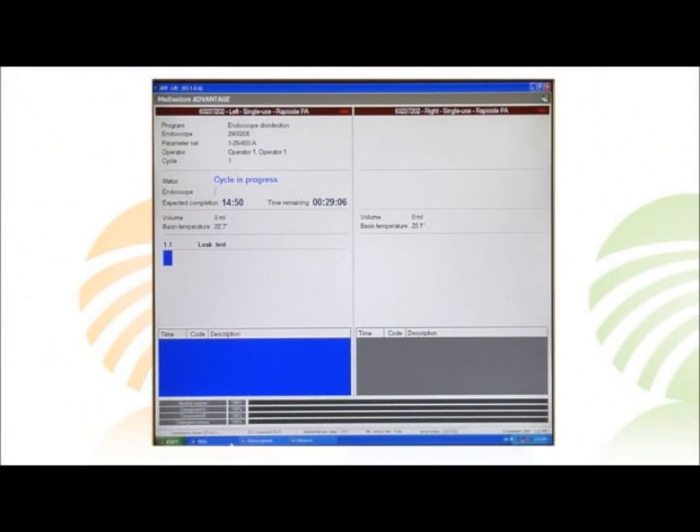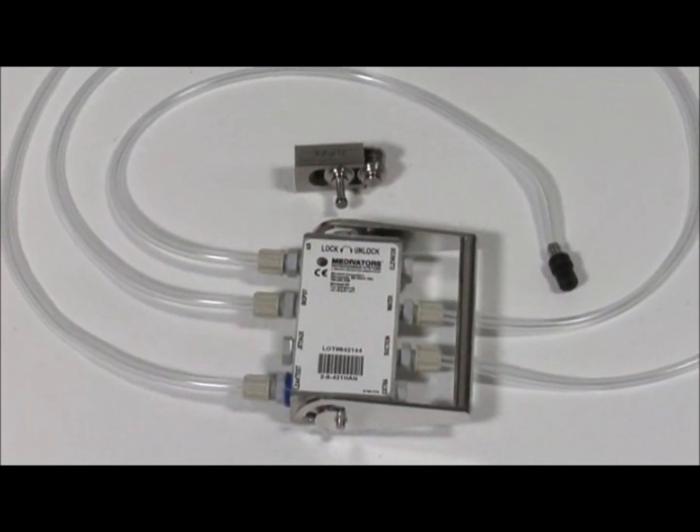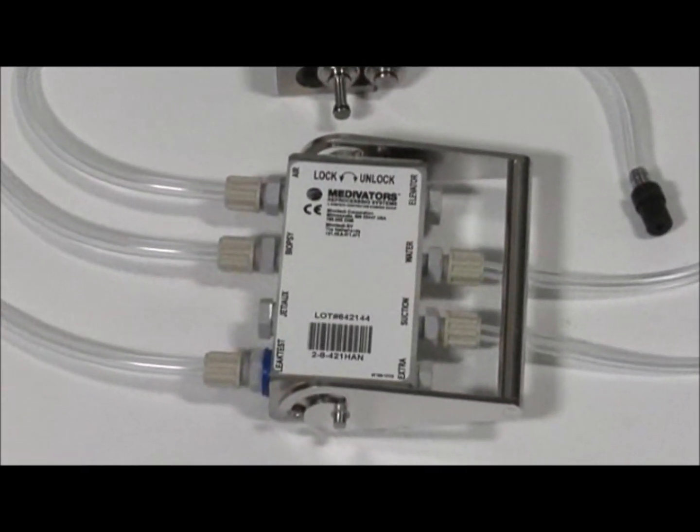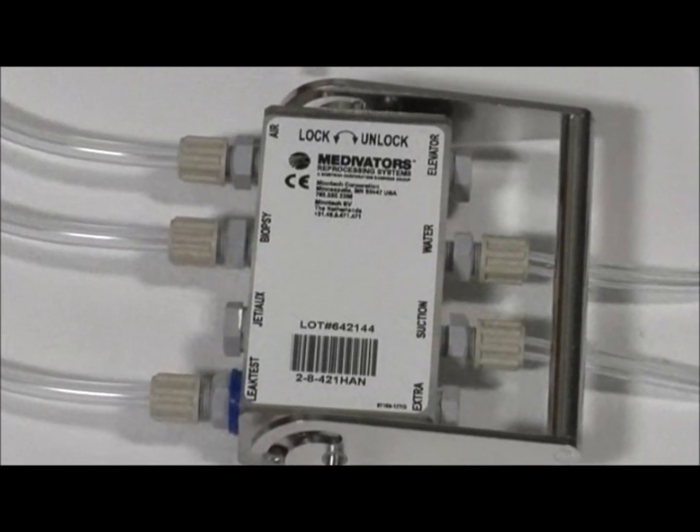The computer system then monitors the channels and can determine if there is a blockage, a leak, or even if a connector pops off. Each endoscope model or family requires a unique hookup block to ensure proper disinfection can be achieved.